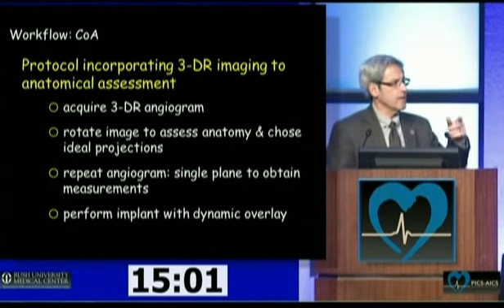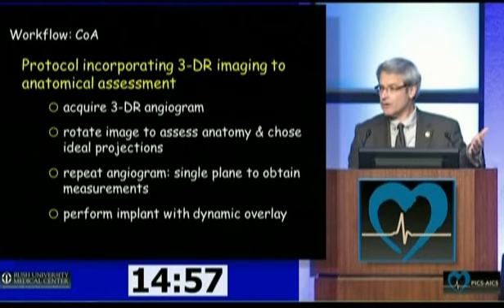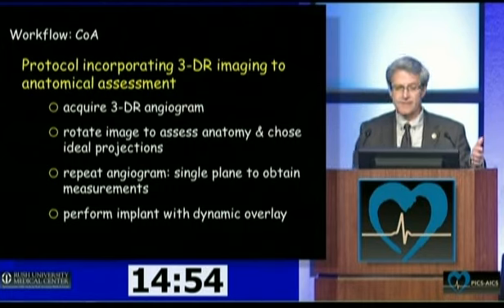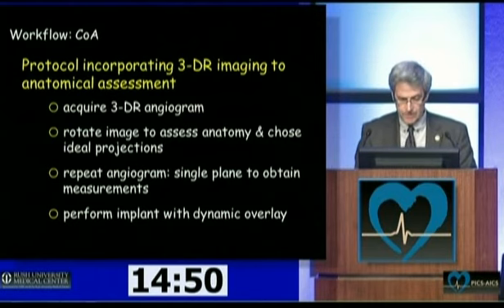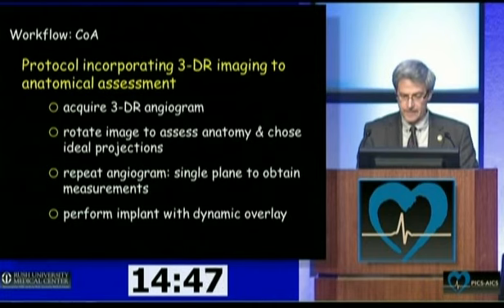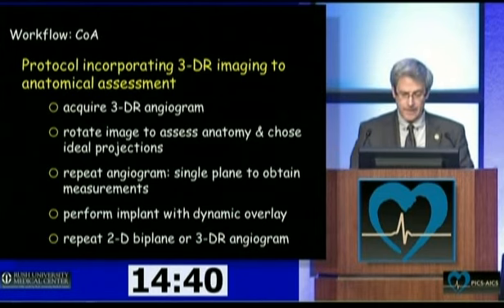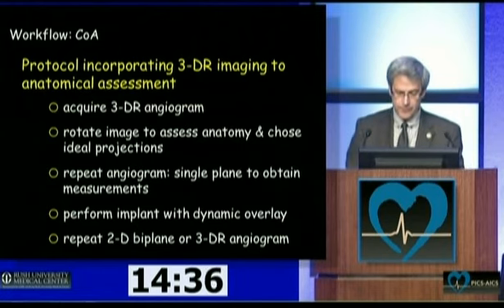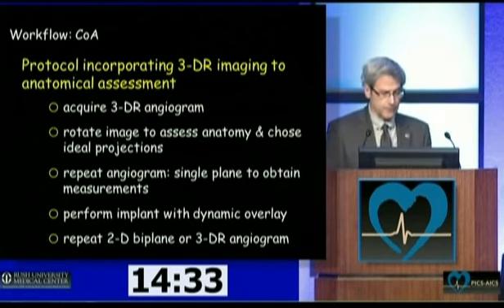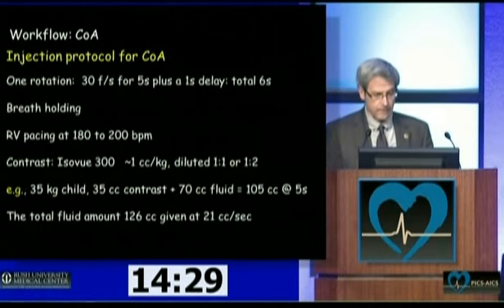And I think Carlos this morning showed a stent implantation where he had acquired the image, and he was able to overlay it into live fluoroscopy, which is a very useful technology that you can use with this kind of acquisition. And then you may or may not repeat the 3D study. We're doing a research study, so we do the 3D acquisition, but you can repeat biplane again to examine the wall of the vessel.